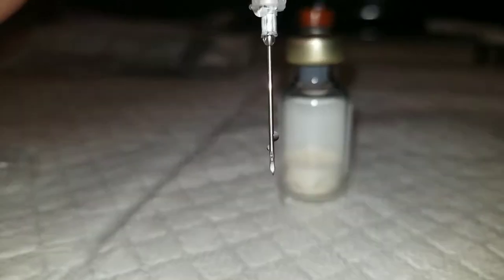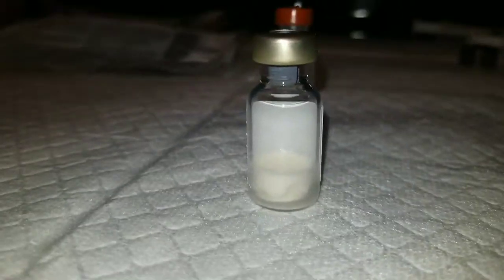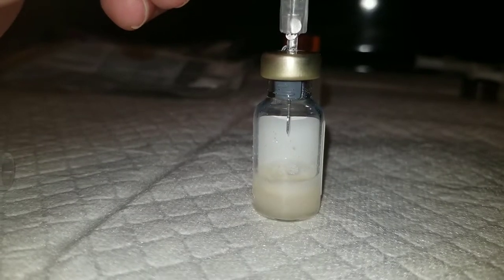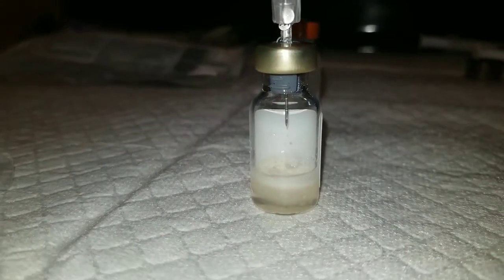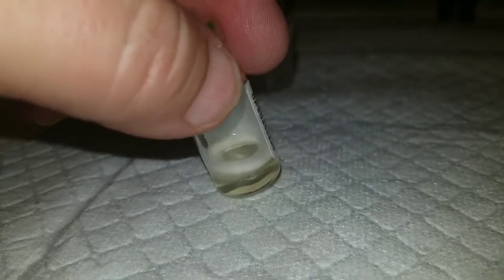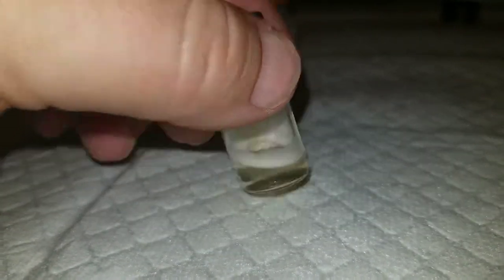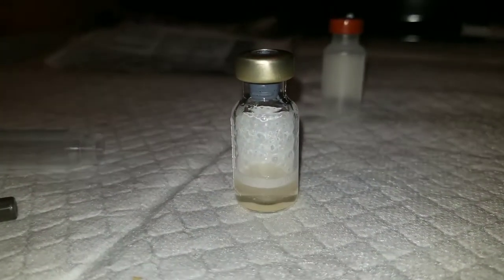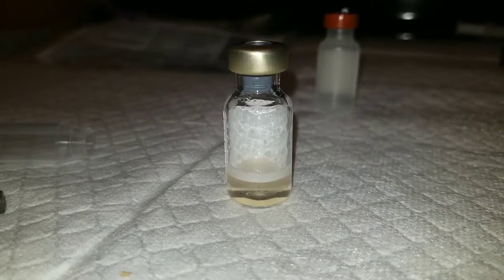Now it's time for the powder. Place the needle into the gray stopper all the way down, and the pressure mixes it for you — though not all the way. It does mix it really well. If you don't think it's mixed enough, you can roll it — you don't want to shake it because if you shake it, it creates too many bubbles. I usually roll it between the palms of my hands. There it is, all mixed up.